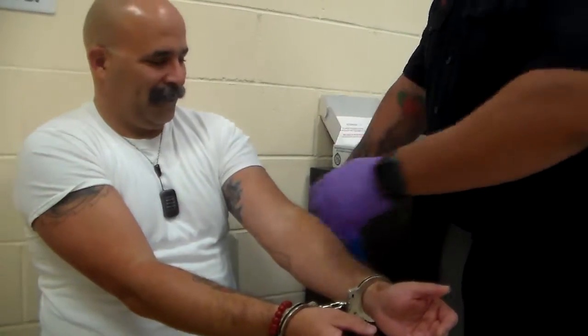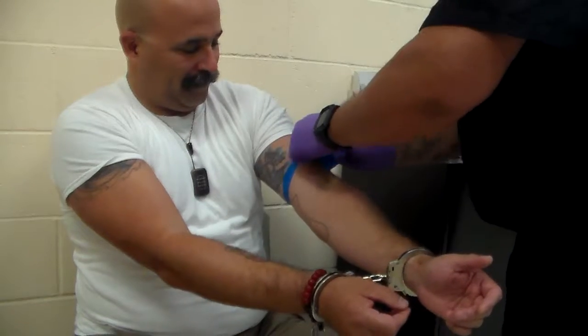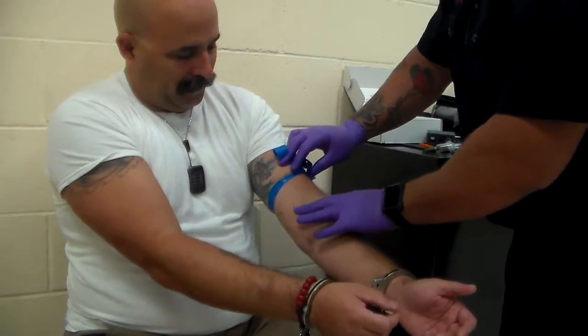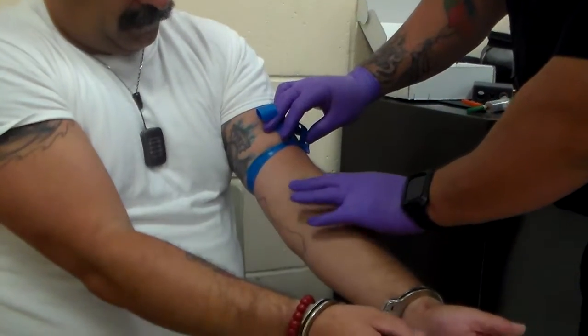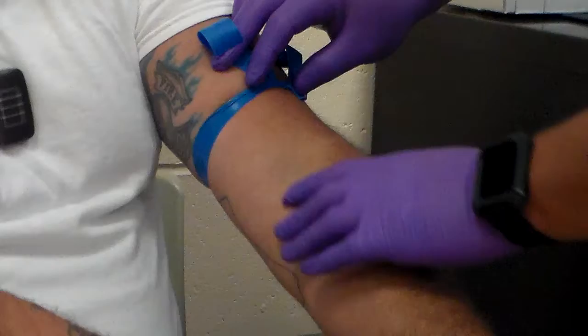At this point, you'll go ahead and place your constricting band in an effort to allow for the vein for visibility. Upon finding an appropriate venipuncture site, you can start low and work your way up — it depends on what you want to use.